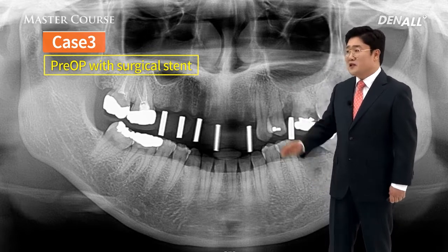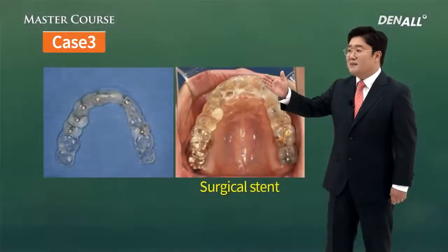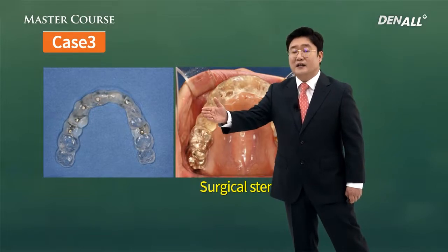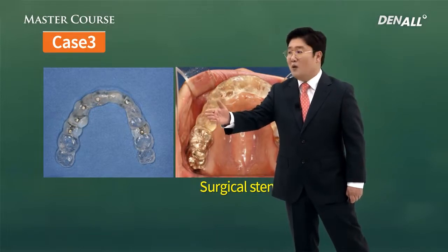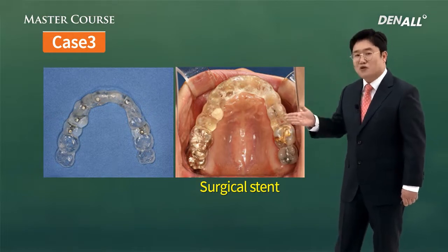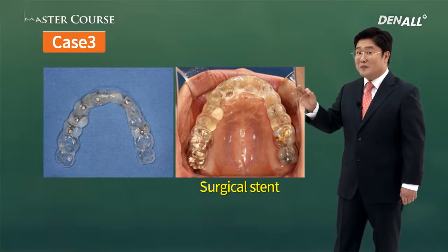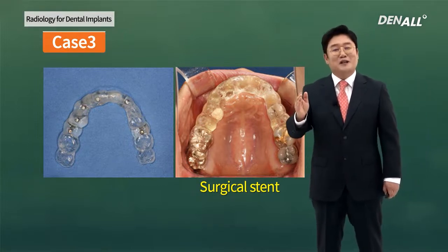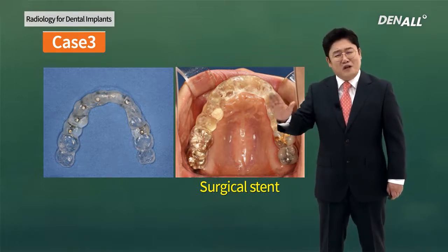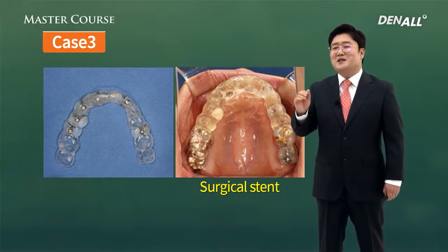If implants are identified, the radiologic stent, X-ray stent, or X-ray template or guide would be removed, and the metal rods are removed. The template with holes will be delivered to the mouth of a patient, and the holes will guide the drilling. This can be considered a very primitive version of the template, the one that you saw used in the digital guided implant surgery.